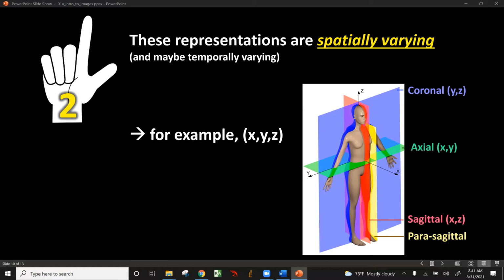For example, the XYZ domain of the volume of the patient, and the different planes are represented there. The axial, usually called XY. And I'm puzzled why this one seems to be a left-handed coordinate system shown in this image. Am I right about that? I think so. I wonder why they chose a left-handed system. Well, anyway, that would put the coronal as the YZ, as shown there, and the sagittal as the XZ.